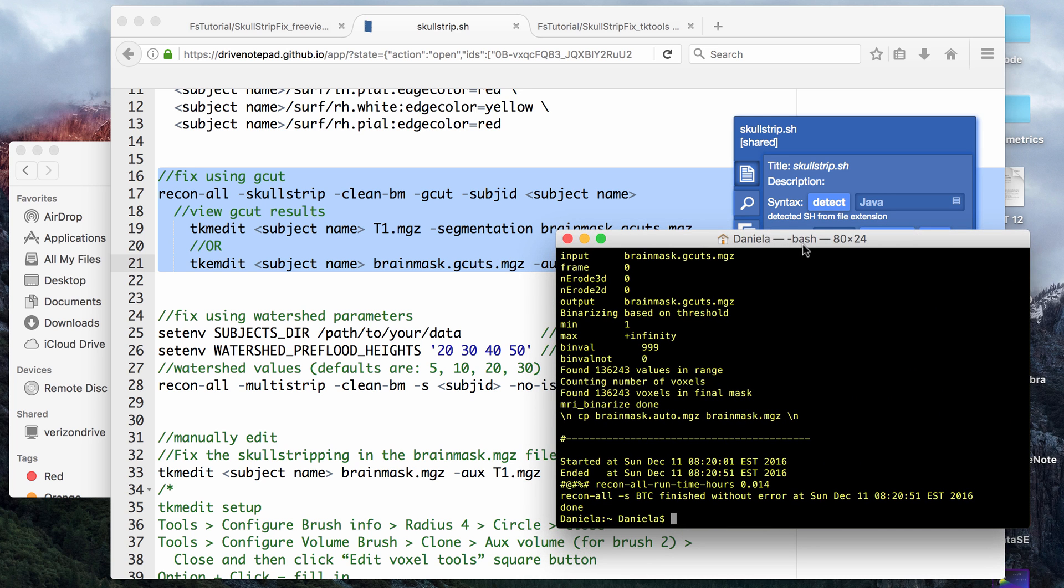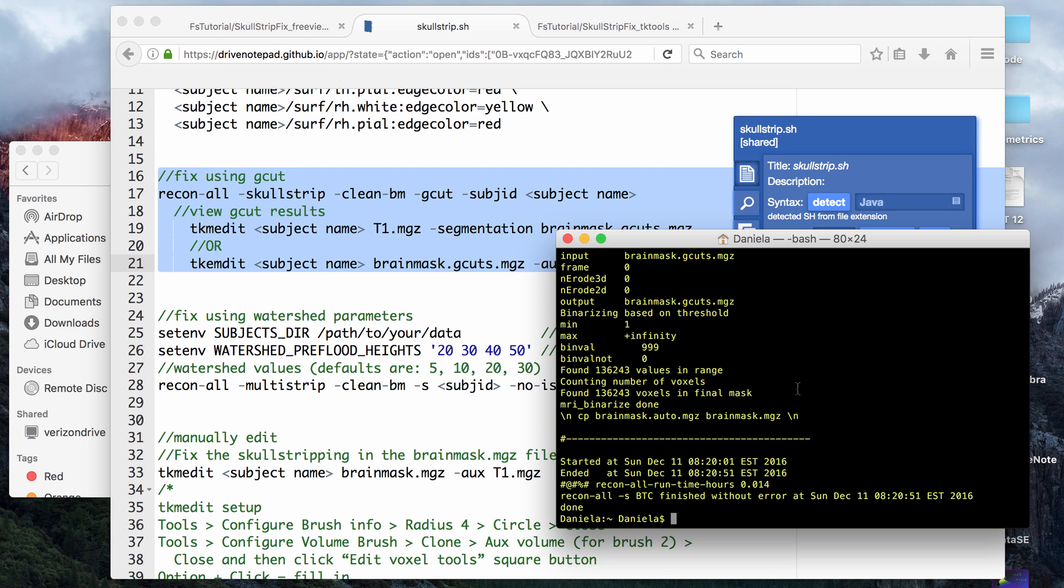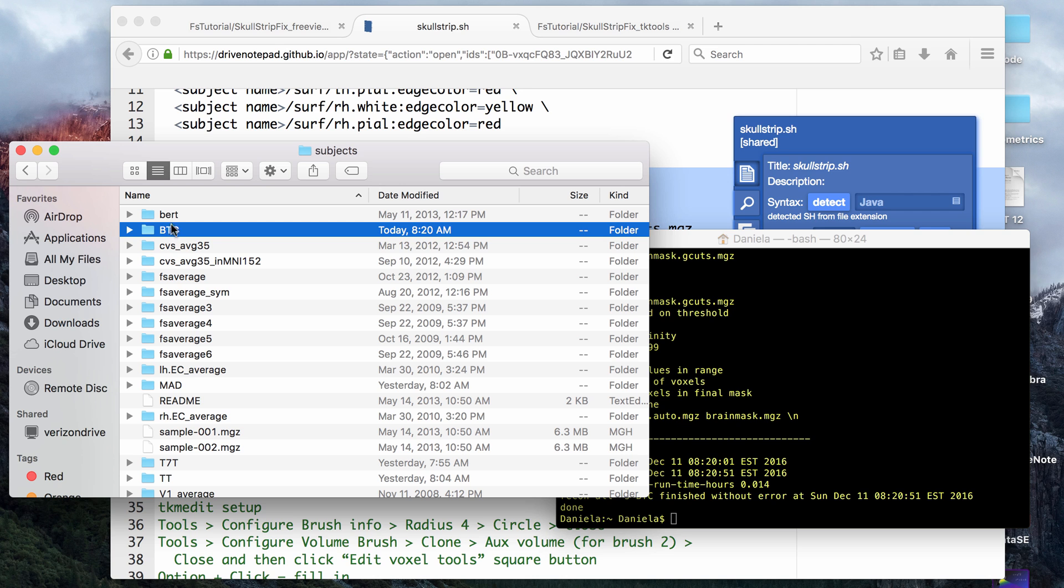And so for this computer, it took less than a minute to run, and it lets you know that it finished without error. Something else that I do want to mention is that sometimes I've tried to use the gcut command, and it actually fails. So it fails sometimes when it thinks it cut out too much of the brain, and it will tell you in a text right around here, usually the last line before this dash line. It will say that the gcut command cut out too much of the brain, and instead of producing a gcuts.mgz file, it's just going to use the brainmask.mgz file.